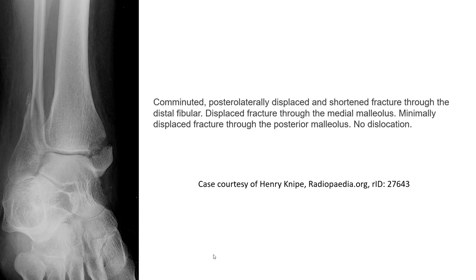This is the first example of trimalleolar fractures, which shows a comminuted, posteriorly and laterally displaced, shortened fracture through the distal fibula, a displaced fracture through the medial malleolus, and a minimally displaced fracture through the posterior malleolus with no dislocation. So we can see all three components of the malleolar fractures — this is called a trimalleolar fracture.